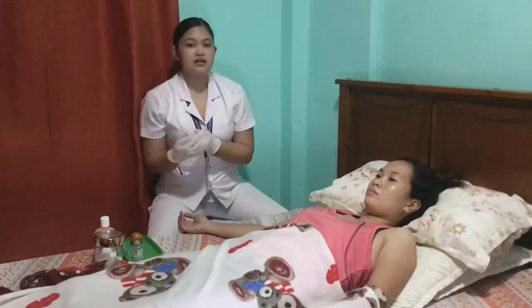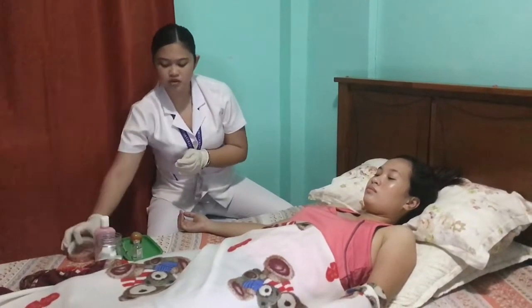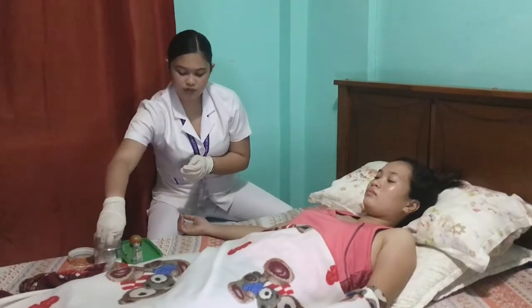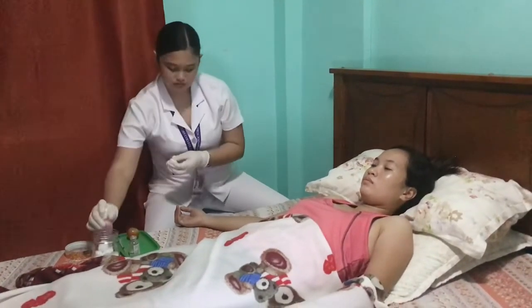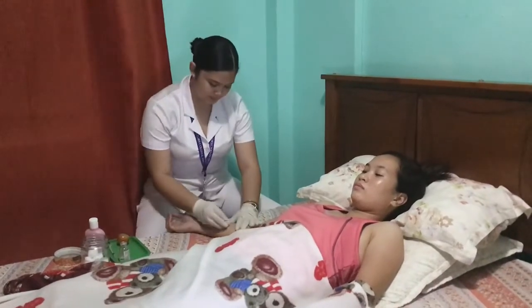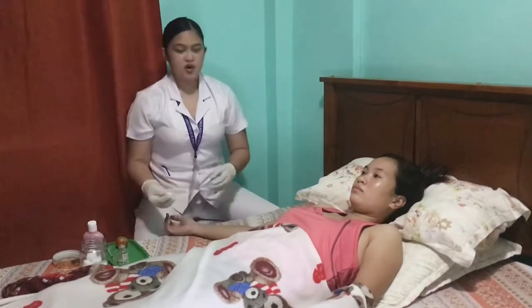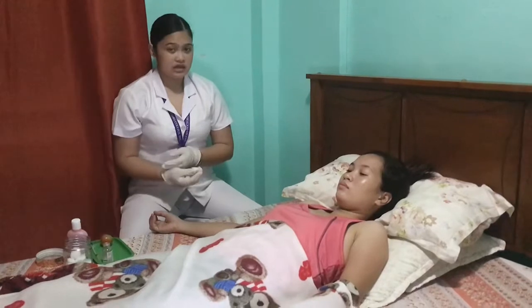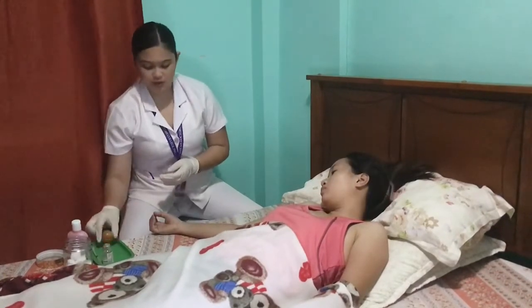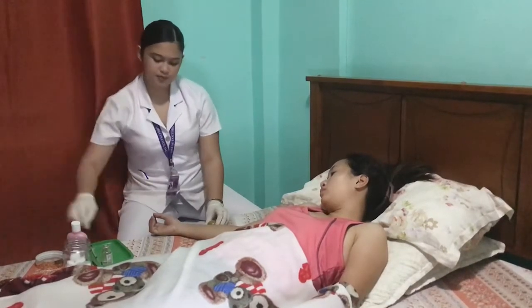Then use an antiseptic swab. Start at the beginning with a circular motion outward, about 2 to 5 centimeters. So since we're not advised to directly inject on the patient's skin, we have improvised a tomato. We have our needle cap here.